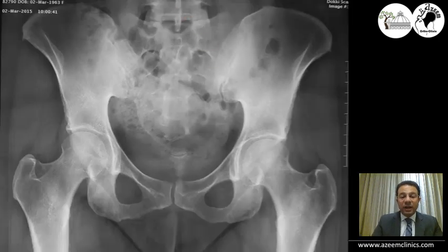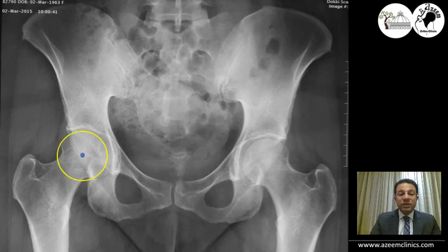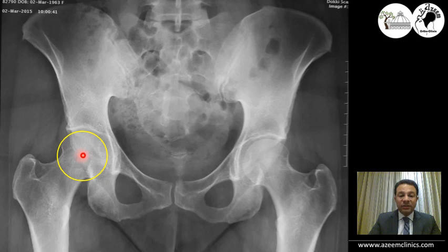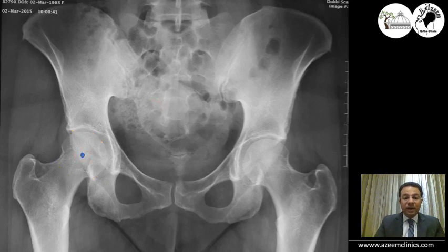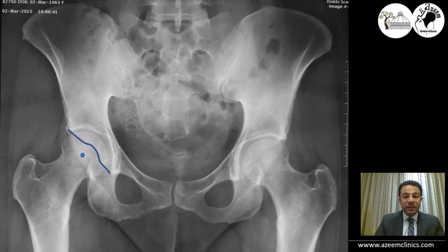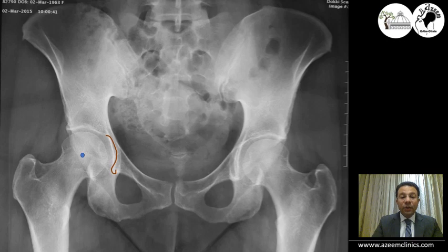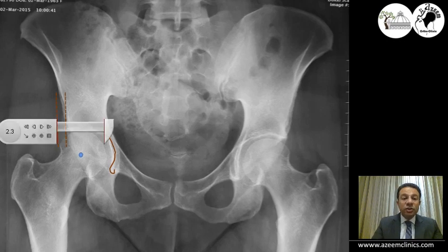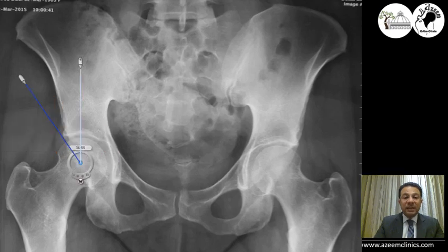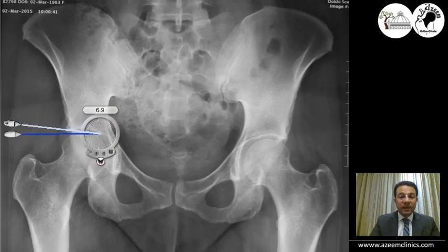Application of this on radiographs. This is a true pelvis radiograph. We first draw the center of the head by drawing the circle of the head and dividing it into two lines — the meeting point is the center of the head. Once you get the center, you draw the anterior wall line and the posterior wall line. That's a normal relationship. Then measure the floor, the extrusion index, the lateral central edge angle, and the acetabular index.